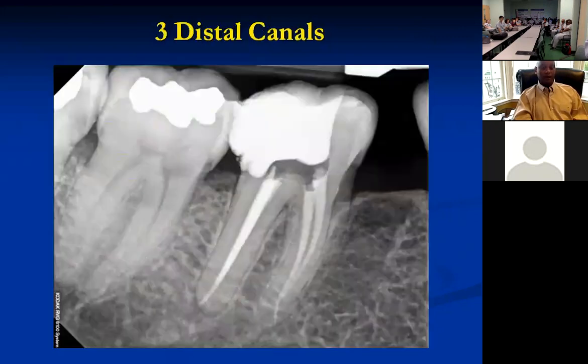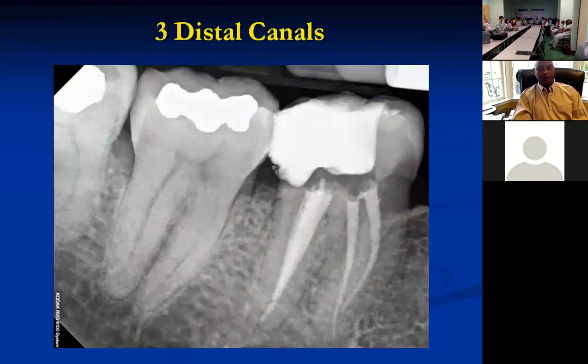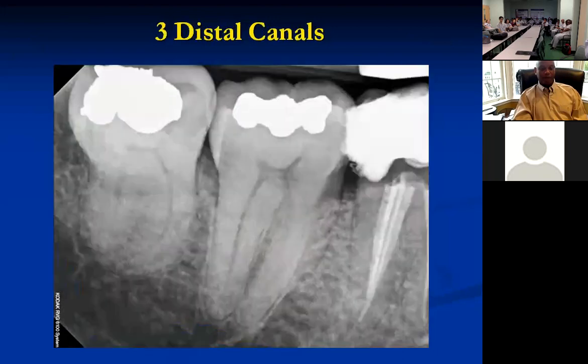All right, here's the final X-ray of that tooth. When you look at it straight-on, it just looks like 3 canals. But if you try to get some angled X-rays, they join apically, and that's what it looks like on an angled X-ray. Here's another angle just to get a little bit more separation. It's a wider angle to get more separation of those three distals.